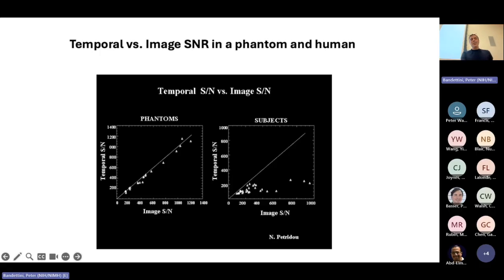If you do that, the signal to noise could be very high for your RF coil, but the temporal signal to noise doesn't really get up that high. At the most, it's about 100 to 1. Here, actually, this was about 200, but this is an early study. So basically, physiologic noise dominates.